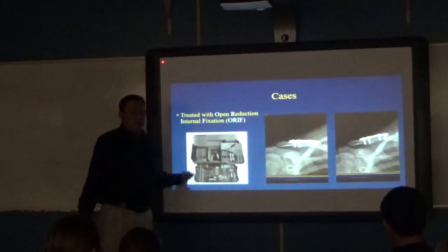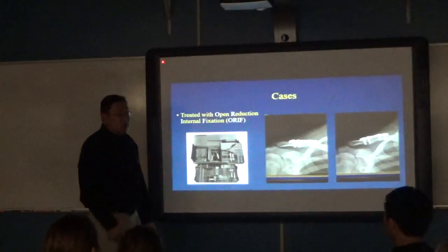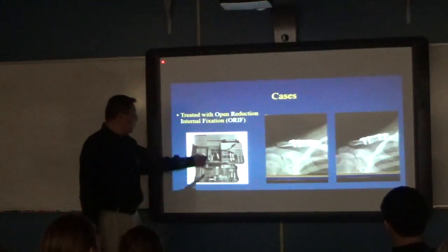I love orthopedics. We've got the best tools in the operating room, plates and screws. You can't go to Lowe's or Home Depot and get those because they will rust. These are stainless steel.